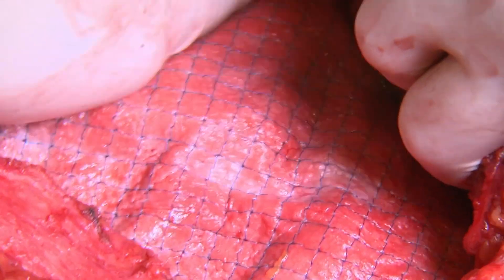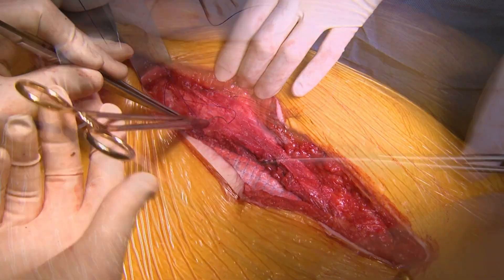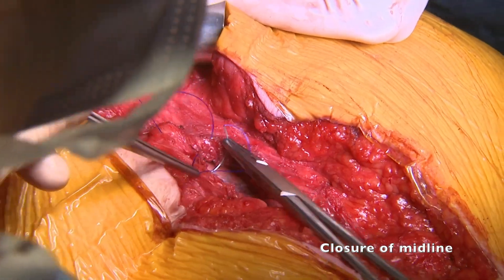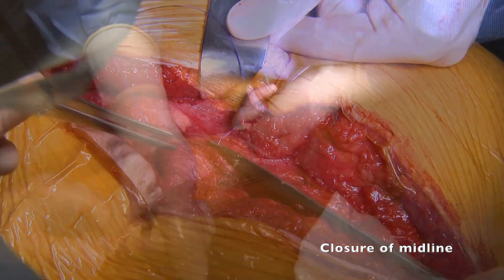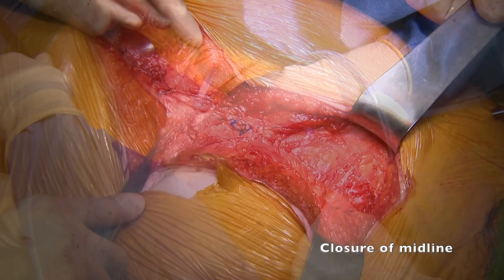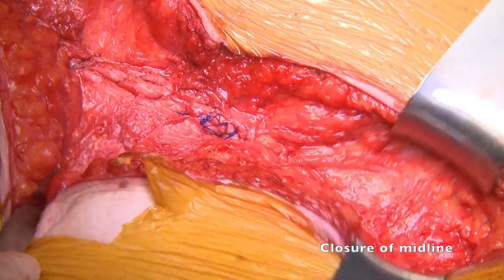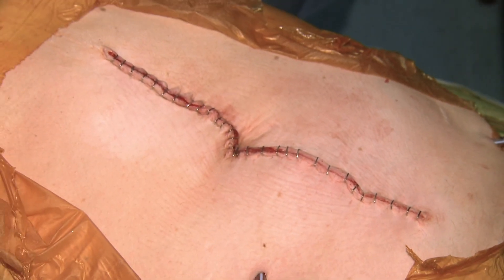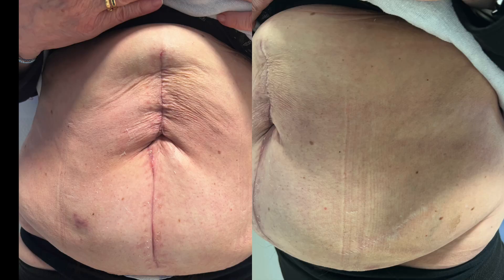The reinforced material used is a six-layer construct with a smooth side that can be placed intraperitoneally. In this case, we left the visceral side outward, giving additional reinforcement to the peritoneum. We restored the linea alba with polypropylene suture, including the previous well-integrated onlay mesh. After placement, a drain was placed between the mesh and the abdominal wall, the skin was closed, and closed VAC therapy was maintained. The patient was discharged uneventfully on the sixth day, remaining completely asymptomatic.